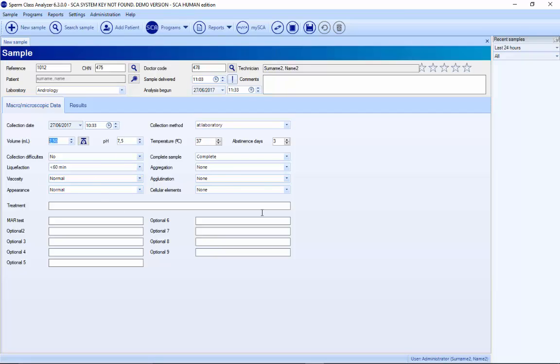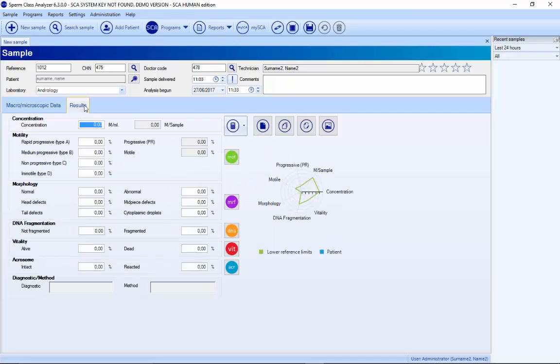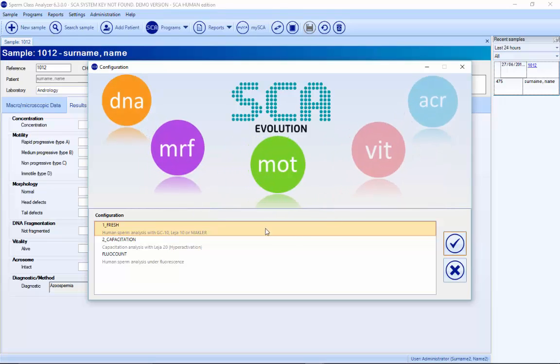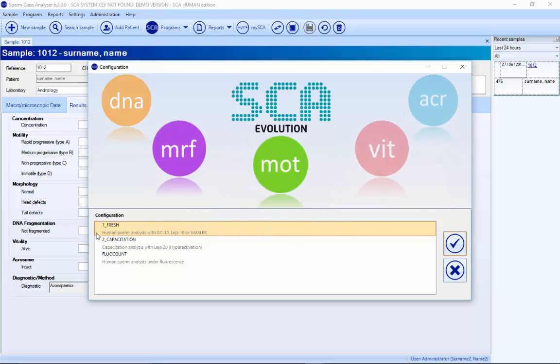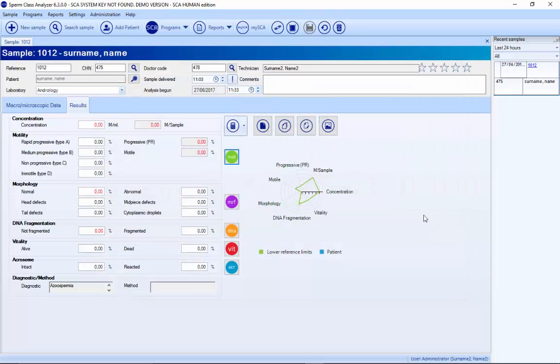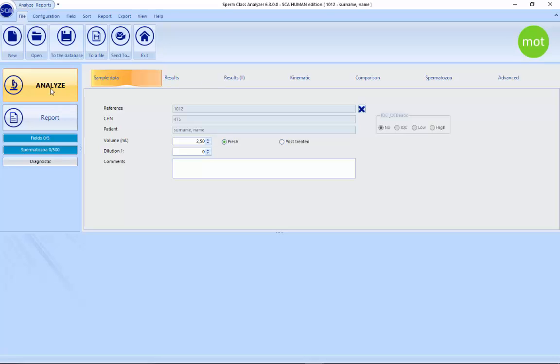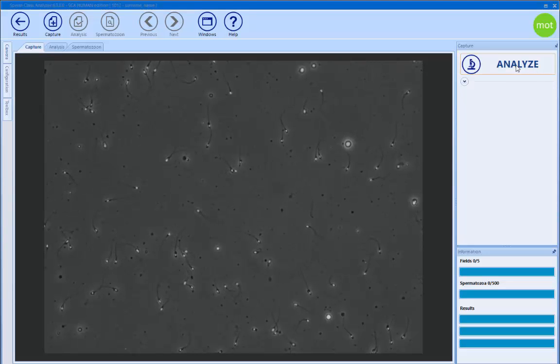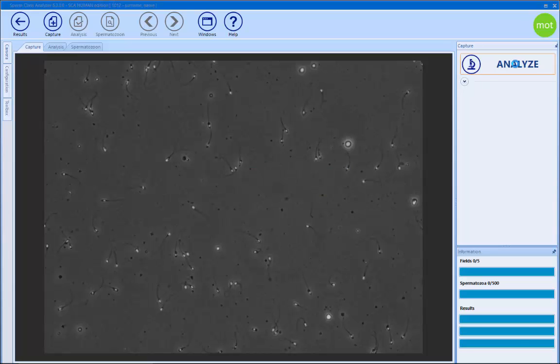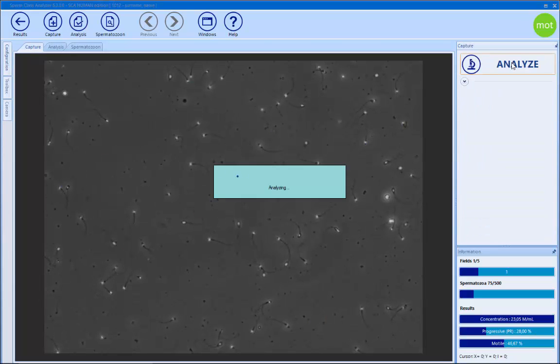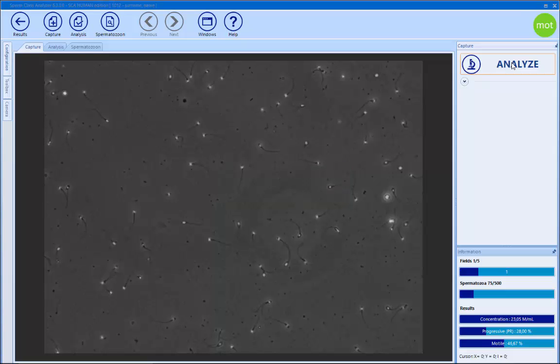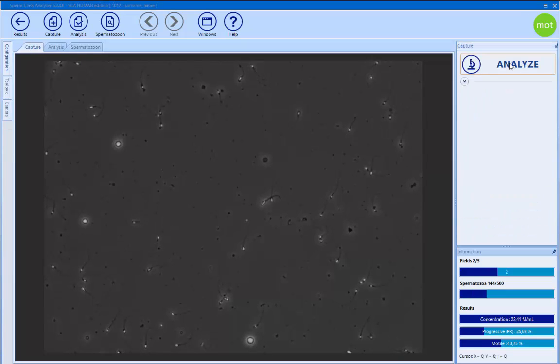Once we have everything filled in, we go to results and we have the different analyses. I will start with the motility analysis. Now everything is faster to change from one model to another. I select the configuration I want — for example, the fresh analysis — and then I go to analyze and capture three fields. It analyzes the different parts of the sperm and checks if it has a tail or not. There is an intelligent filter to automatically delete all objects that have no tail.